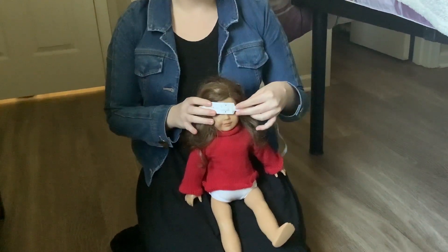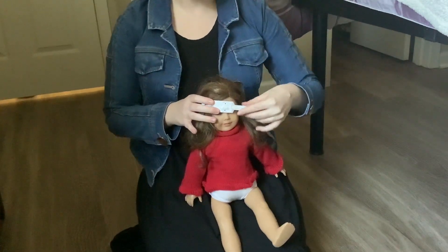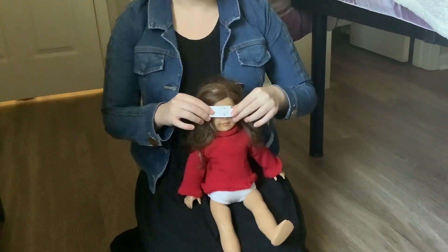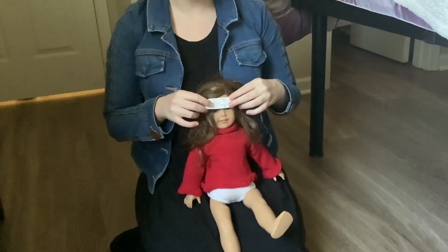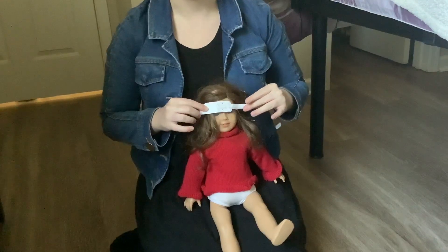Once you have completed this one time, you're going to need to do it twice more. By doing so, you can simply loosen the tape, readjust the baby, and then pull it tight again and read out the measurement.